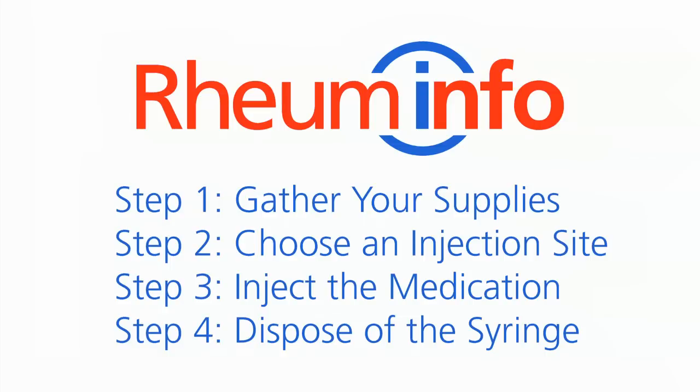Okay, let's get on with the injection. We're going to teach you how to inject using four basic steps. Step one, gather your supplies. Step two, choose and prepare an injection site. Step three, inject the medicine. And step four, dispose of the syringe.